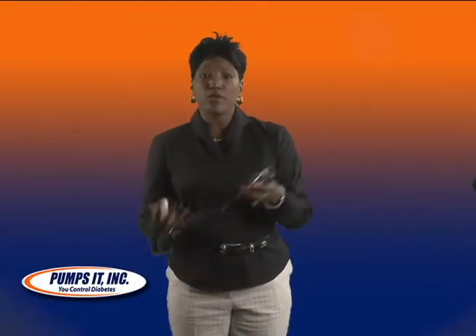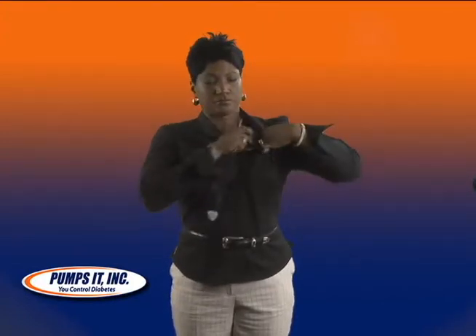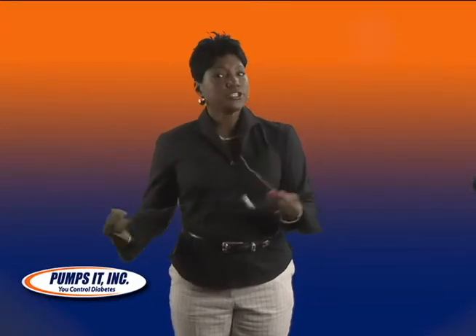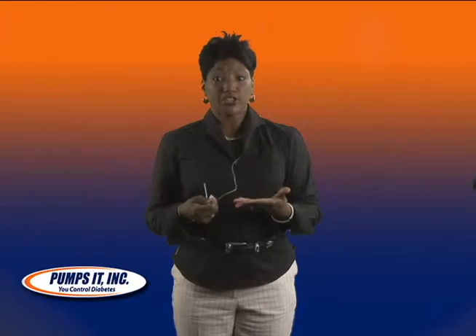One of the most common places that women wear their insulin pump is in their bra. It's very discreet, it's readily available to make changes, and there are no accessories that you need to purchase for this.